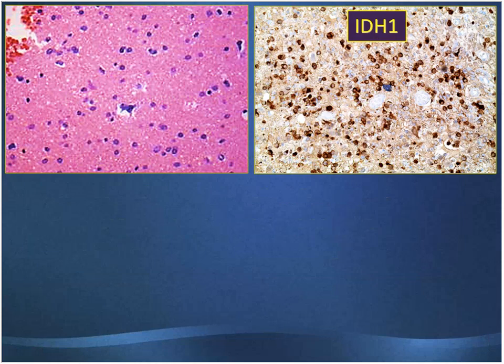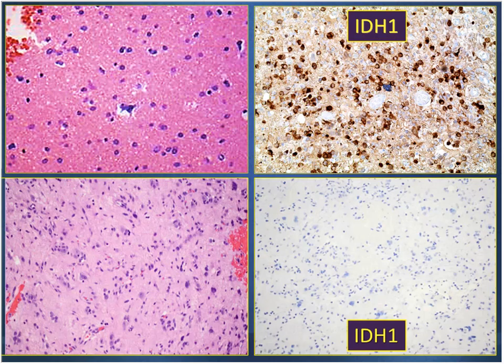And here is an example of the low-grade diffuse astrocytoma positive for IDH1, nuclear and cytoplasmic. And here is a higher-grade tumor which is negative in the lower corner.